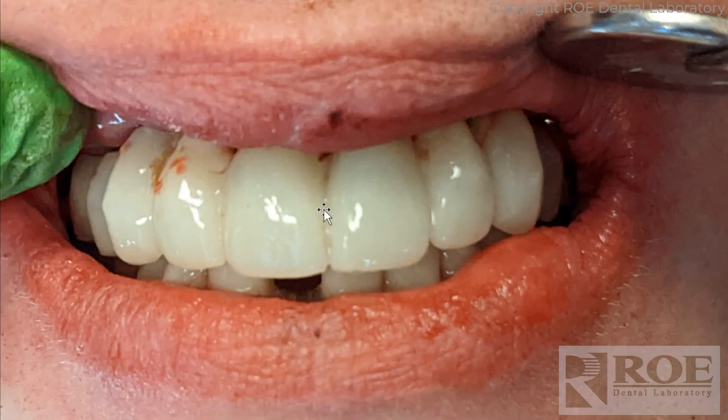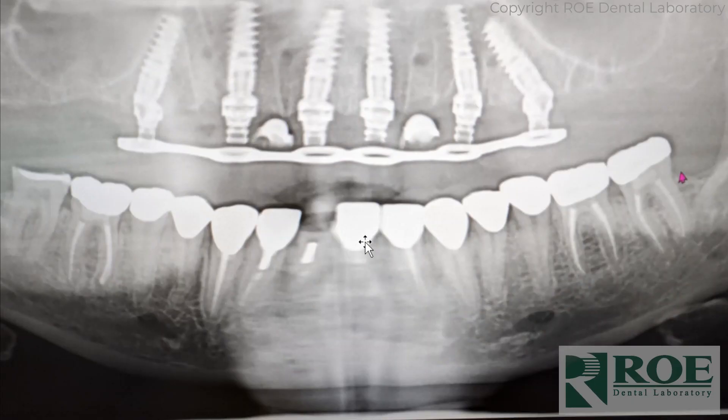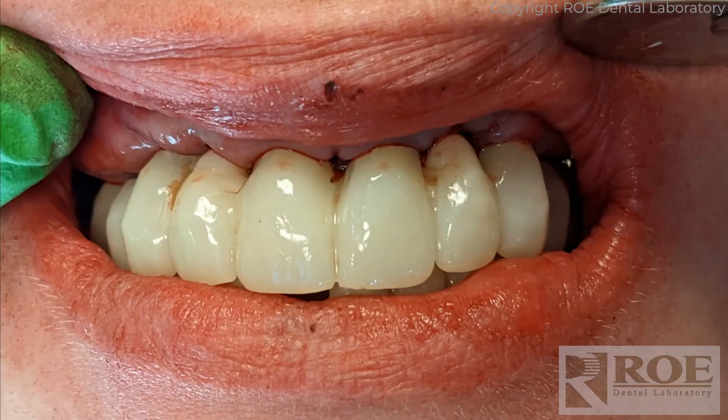Delivery — showing the tissue, which is always what we want to see in these natural surgeries. Looking good. The doctor added composite outside the mouth — normal flowable composite — tried it in and added some more, no pressure on the tissue, just met the tissue, and the case looked terrific. Post-op implants were down, and that is our FP1 Natural Chrome. Please ask any questions — we want to support doctors in any way possible on these cases. It's just a tremendous alternative.